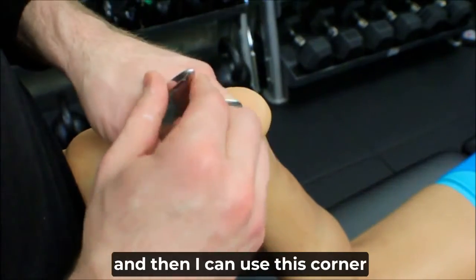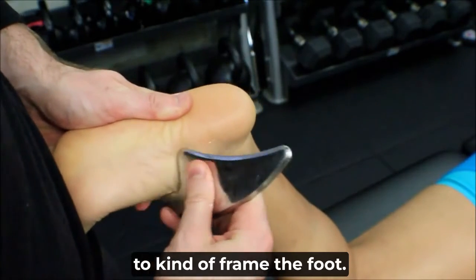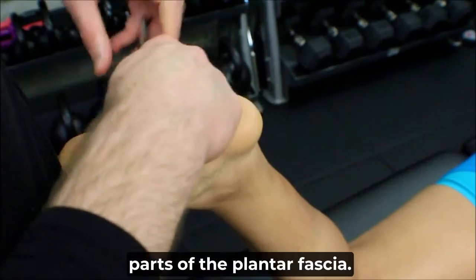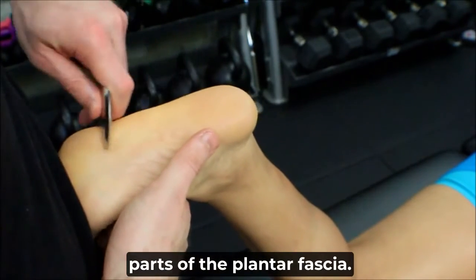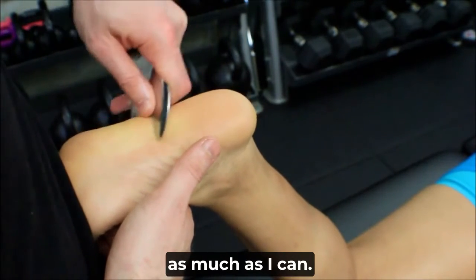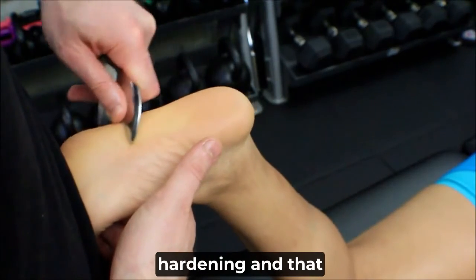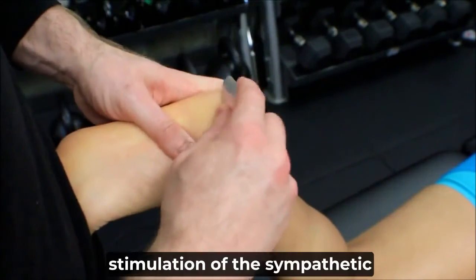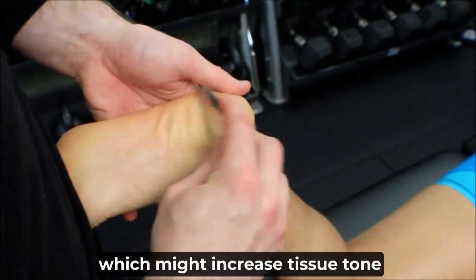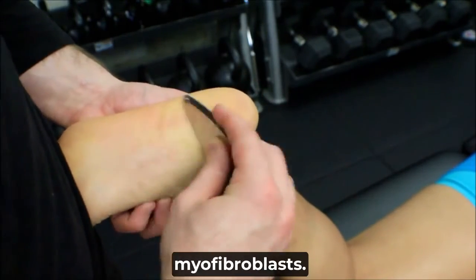And then I can use this corner to frame the foot, get at some of those other parts of the plantar fascia. I really try to affect as much as I can. Once again, going for that strain hardening and that stimulation of the sympathetic system, which might increase tissue tone a little bit via those myofibroblasts.